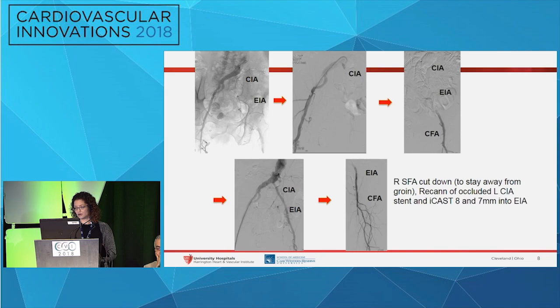I was able to hook that part of the sheath, and then from there we were able to stay true lumen, stay within the stent, not go outside the stent, and using a combination of Stiff Glide and Quick-Cross catheters, I was able to get down to the external iliac artery where she was back in true lumen and patent.